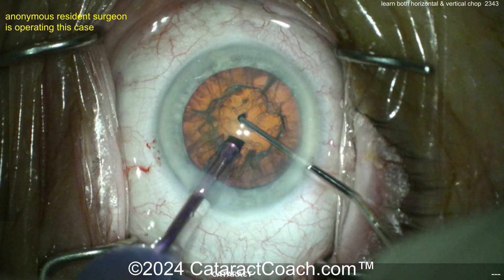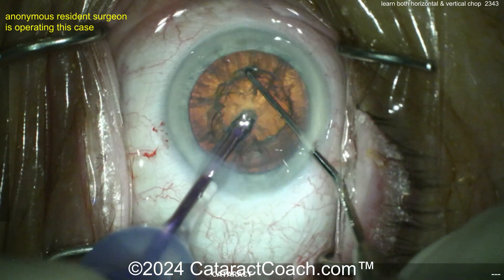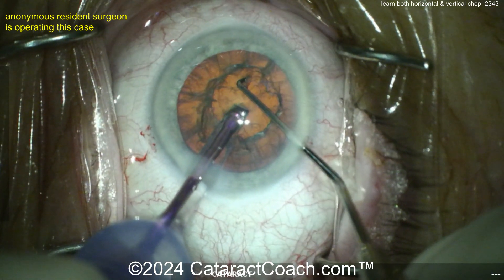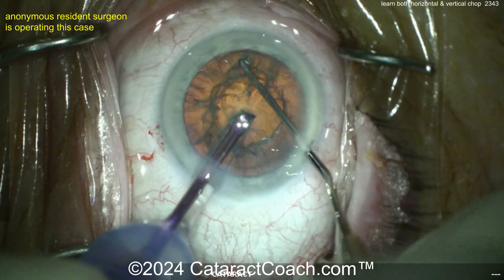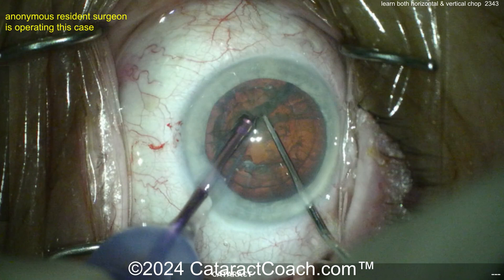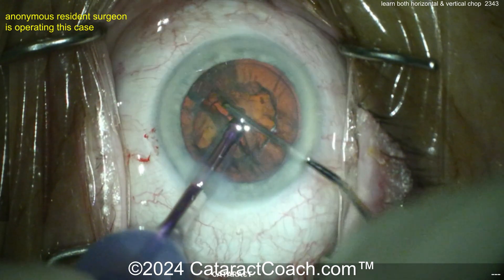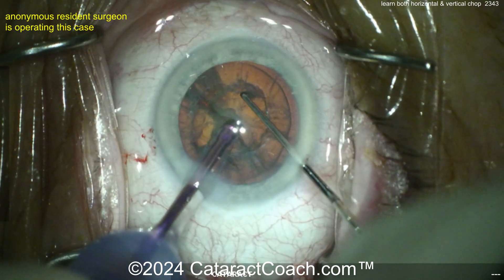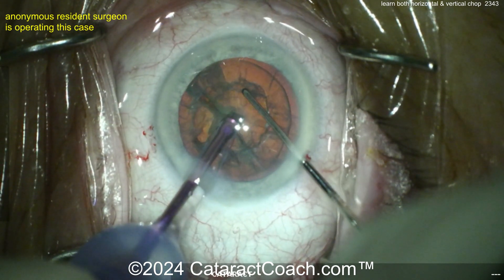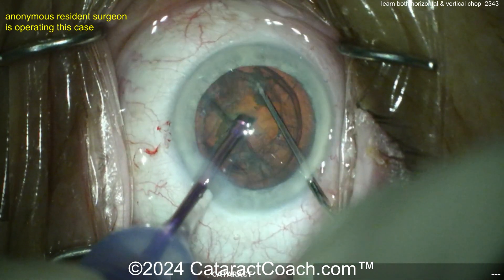Now here we go, let's watch the first one here. The FACO probe going in, chopper going around the equator — that's going to be a horizontal chop. Get a good purchase on the nucleus, chopper goes around the lens equator, under the anterior capsule, bring the two instruments together and apart, and that's a beautiful horizontal chop. My advice would be to put the FACO probe more in the subincisional space, just inside that subincisional capsulorexis for the first chop.